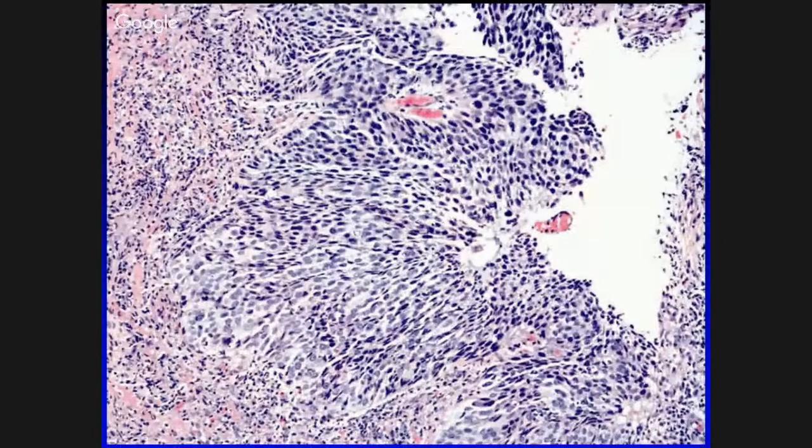So one other point, carcinoma in situ is not to be used for these HPV cancers. If you look at this, and this is crypt epithelium, it looks like it's completely confined to the surface epithelium. And you put the whole tonsil through, there's no invasive cancer that you can detect, yet the patient has metastatic disease. How do we explain that? The fact of the matter is that this epithelium has intraepithelial lymphovascular spaces, and the tumor colonizes those and metastasizes.